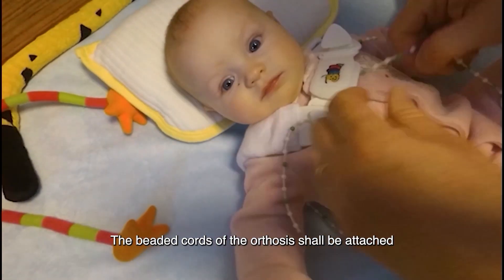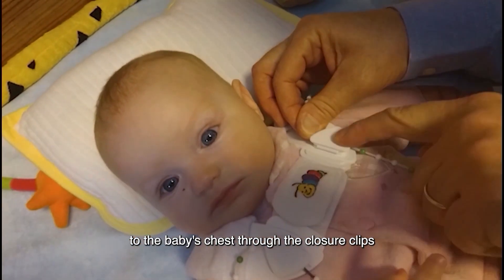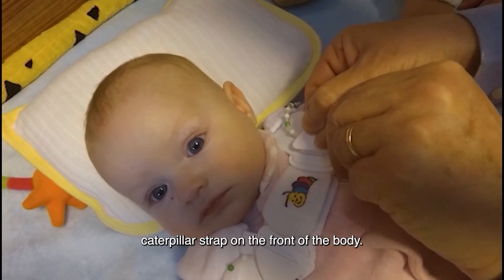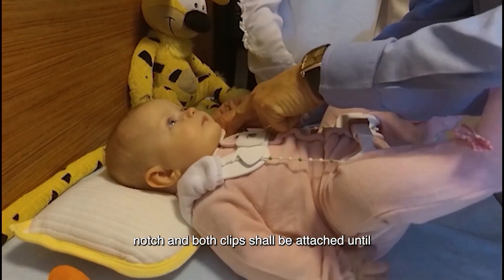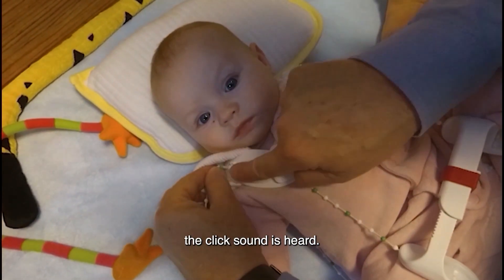The beaded cords of the orthosis shall attach to the baby's chest through the closure clips on the right and left of the caterpillar strap on the front of the body. To do this, the marked bead is pushed into the relevant notch and both clips shall be attached until the click sound is heard.